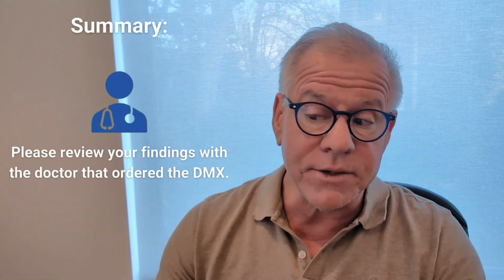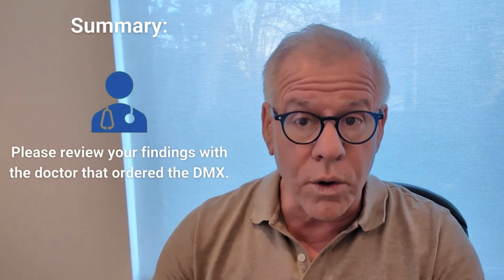So in summary, focus on those three findings because in my experience, those are the three that are most likely to be abnormal and cause problems. You can easily read your own DMX, and obviously please review your findings with the doctor that ordered this study.